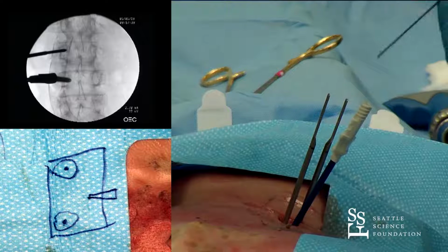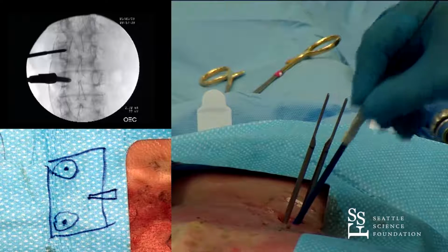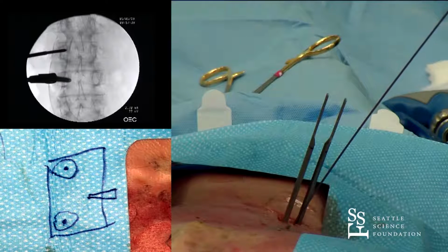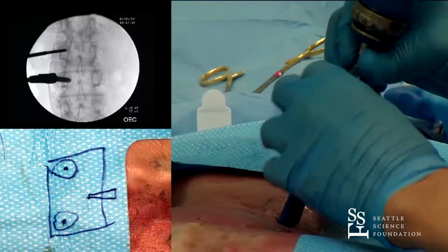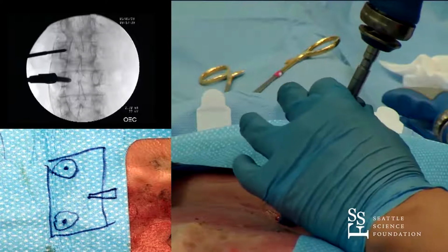Okay, so same thing, guide wire down. Okay. Push the sleeve over the soft tissue first. Great. This is a little bit of a dilator because the last time I did this, I didn't do a good job at it. Okay, it's just going to protect the soft tissue a little bit. Shot.